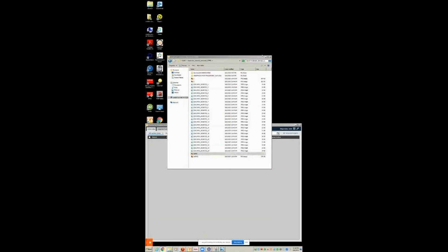So this is computer modeling software done by one company. They won't tell you how, they give you some complex computational analysis, but it works pretty well. Wow. Okay, thank you. All right, those are my cases. All right, Howard.